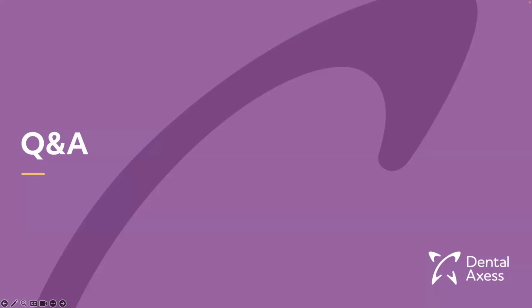So it's the same. If we have a rotation of 10 degrees, remember, it's only 1-2 degrees per aligner. That is the only amount we can achieve per aligner. If we have 10 degrees but we want 3 aligners, those 10 degrees of rotation cannot be achieved. So we need to keep that in mind when we are requesting a reduced treatment plan. That can be done, but the end results, or the final position of the teeth, is going to change. It's not going to be ideal.